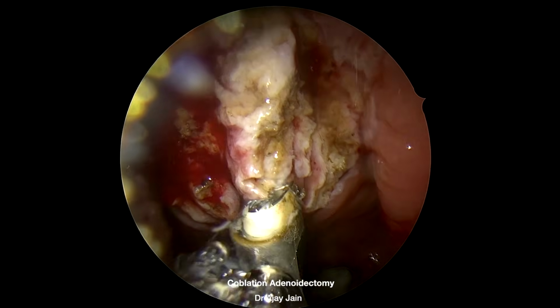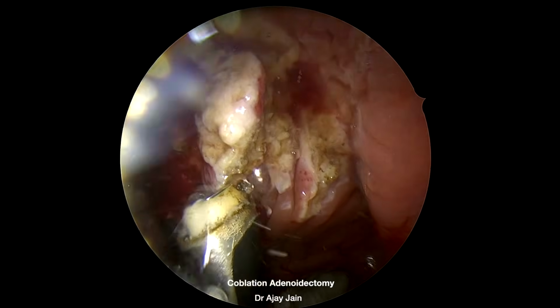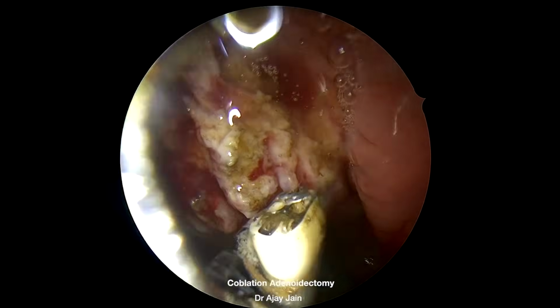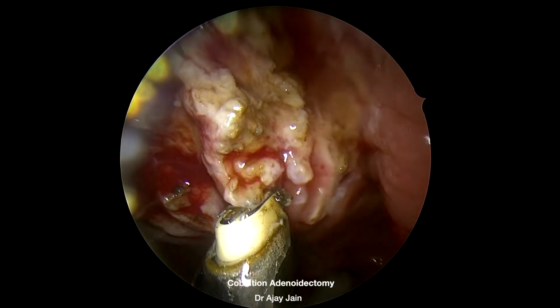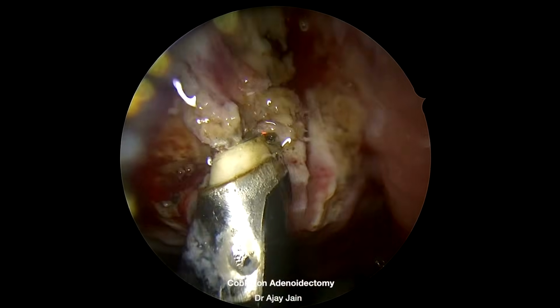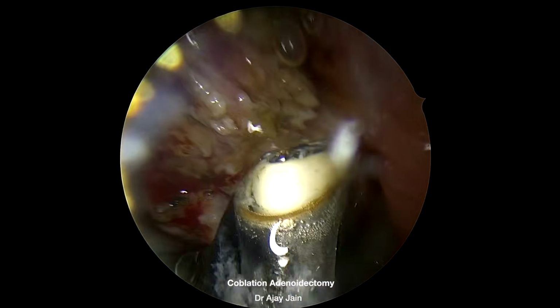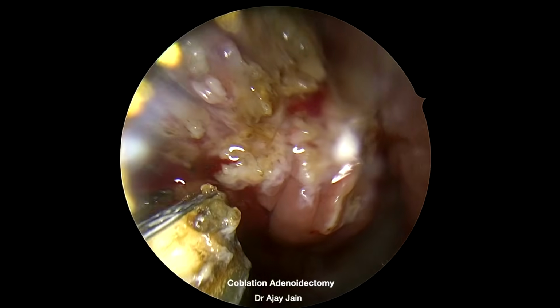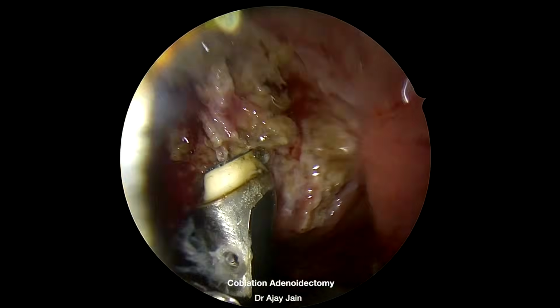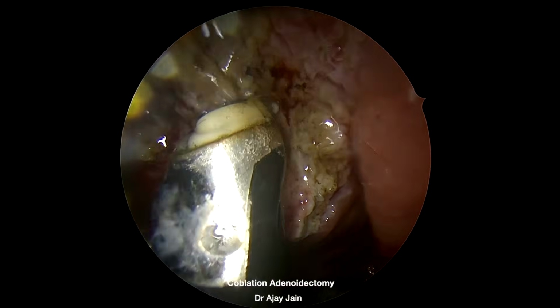Now only a minimum vertical sliver of adenoid tissue is left, and from both sides of this tissue I can debulk it quickly. Since this is an edited video, the surgery may seem easy, but I know this surgery usually takes some time because the wand really requires repeated cleaning.